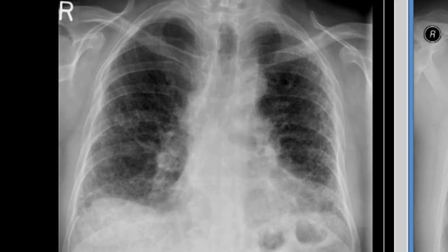Both lungs, as a result of fibrosis, are shrinking in volume, creating architectural distortion and traction bronchiectasis. The slight shift of the trachea toward the left side and its dilatation are also a result of fibrosis. Honeycombing is a result of the scarred interstitium, which shrinks in size and thus results in destruction of alveolar walls, creating multiple thin-walled cysts.